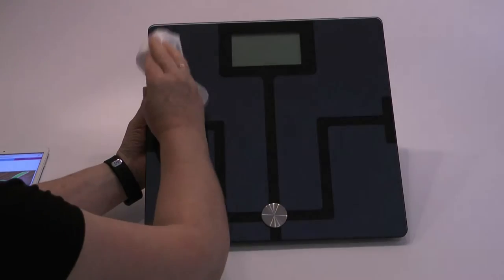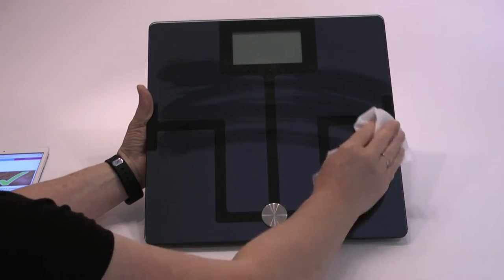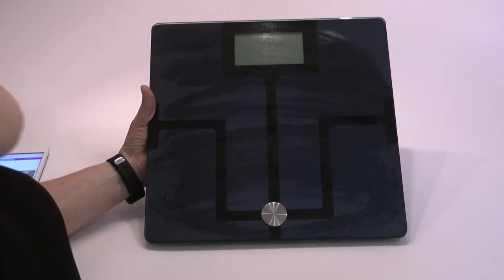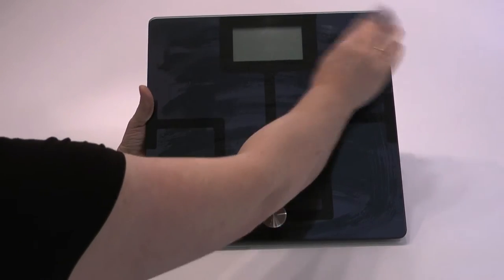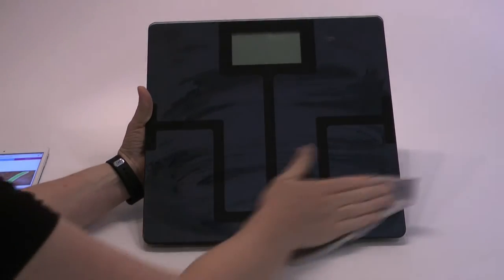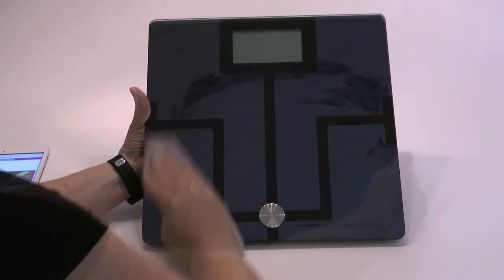The body analyzer can be cleaned using a disinfecting damp cloth on the top surface and then wiped dry. Regularly clean it to make sure the surface is free from dust.